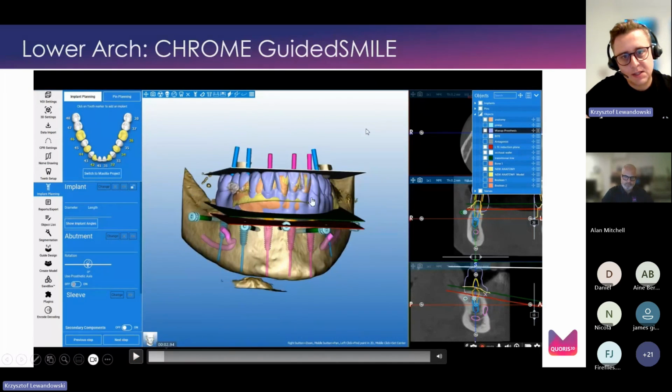On the screen, we can see our wax-up and planes: the reduction plane, which is our bone reduction plane, and the transitional plane, which represents the thickness of the tissue, so it is 3 millimeters above the reduction plane. And we can see the occlusal plane.